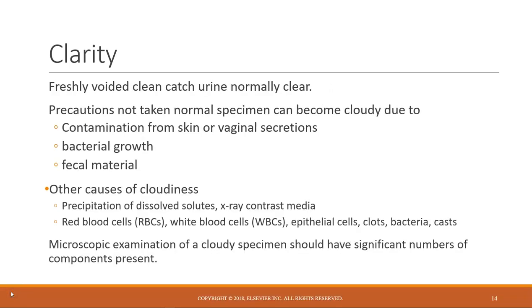Freshly voided clean catch urine is normally clear. If precautions are not taken during collection, a normal sample can become cloudy due to contamination from skin or vaginal secretions, from bacterial growth in the urine, or the presence of fecal material in the urine sample.